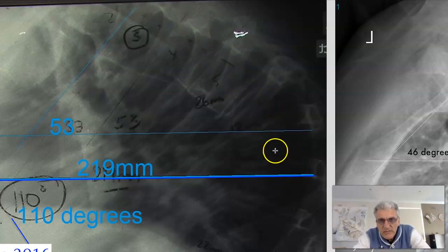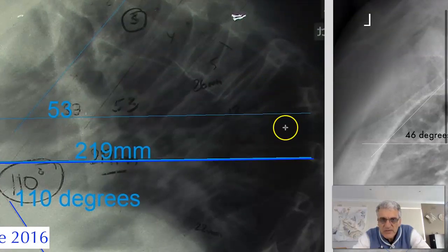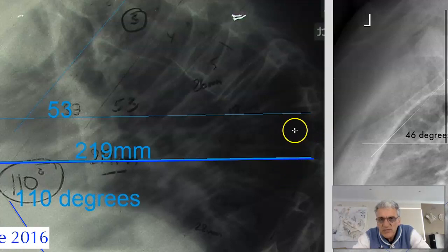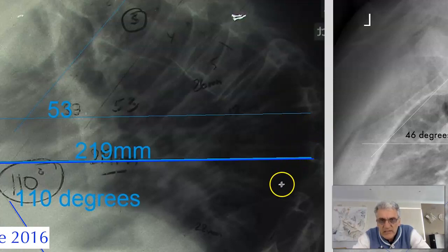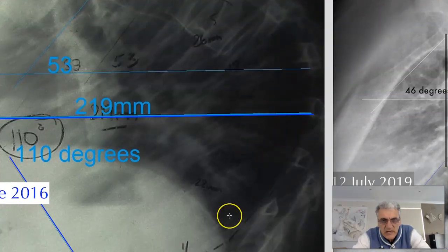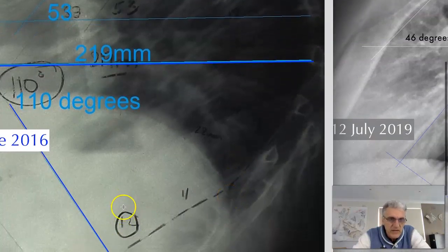Typically the vertebra itself will apex at around T7 and T8. So you can get your bearings from that as well. There's T7, there's T8, there's T9, T10, T11, and T12.